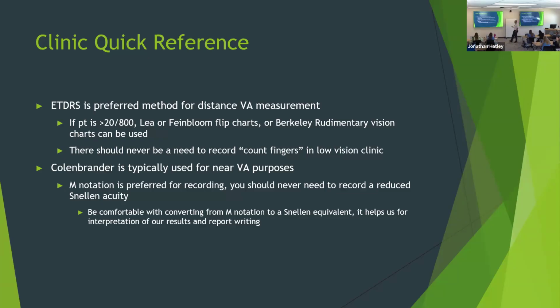And there's nothing wrong with using a shorter working distance, because most of the folks that we're working with are already presbyopic. So it's not like we're causing them to accommodate or anything like that. And because of something that we'll talk about called just noticeable difference, where we have to increase the size of our lenses that we show them, it won't make a huge difference if the chart is closer. It doesn't make a huge difference for patients' visual acuity.